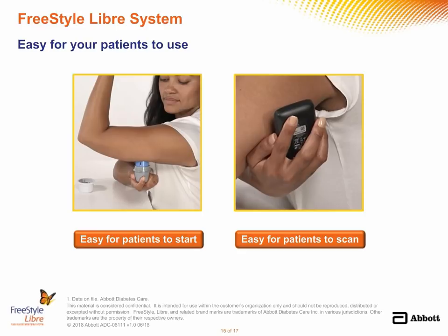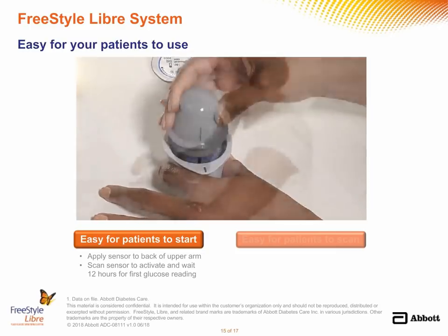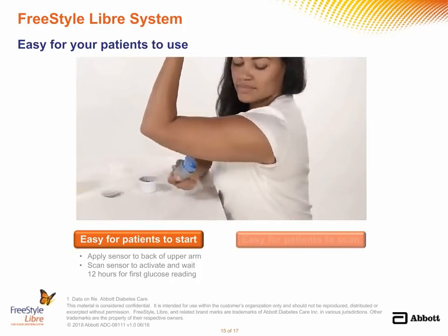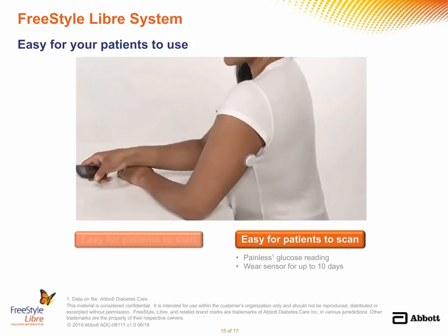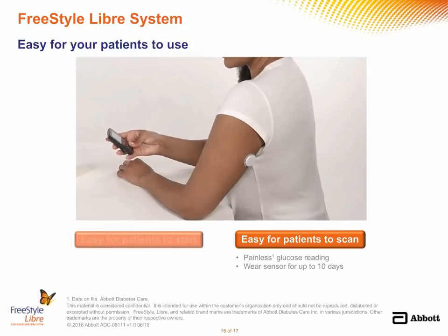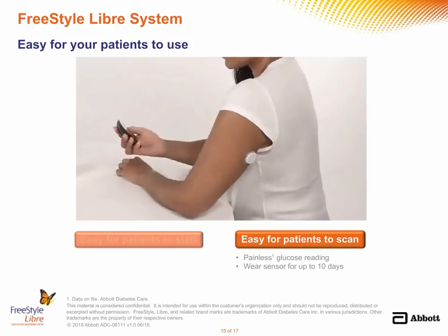First, patients select an area on the back of the upper arm. Second, on a hard and flat surface, patients prepare the sensor pack and sensor applicator. The sensor can be applied to the back of the upper arm using this motion. Lastly, to activate the sensor, patients scan the sensor using the FreeStyle Libre reader and wait 12 hours for their first glucose reading. After the warm-up period, patients can scan as often as they choose for painless glucose results.